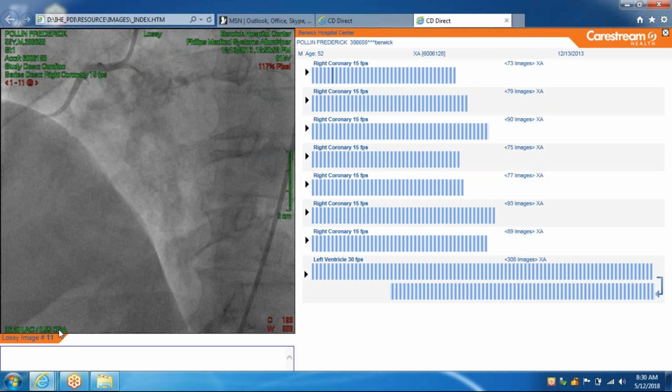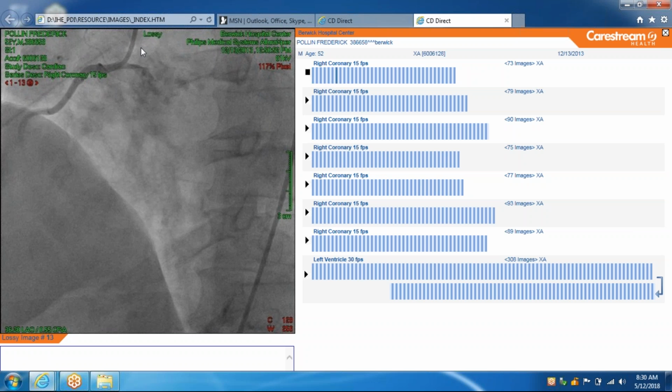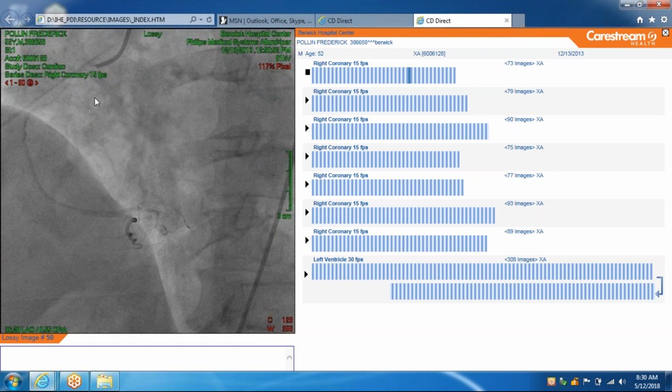So it's almost straightforward LAO, just in the left. So inject. This is the catheter in the blood vessel, and this is another nice smooth blood vessel. You don't see any obstruction.